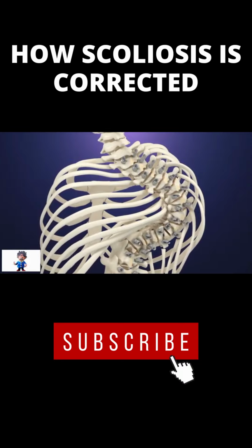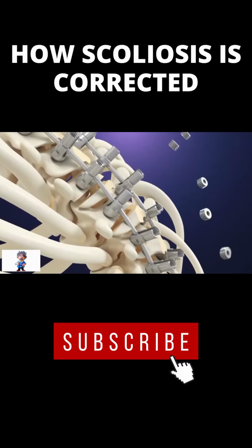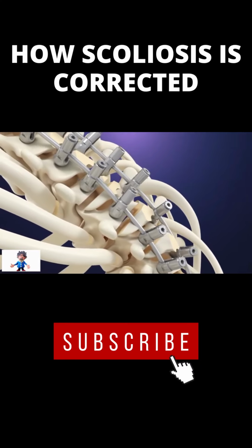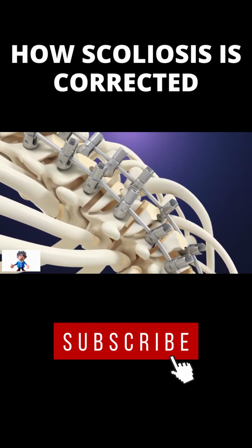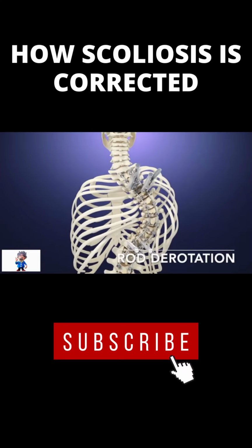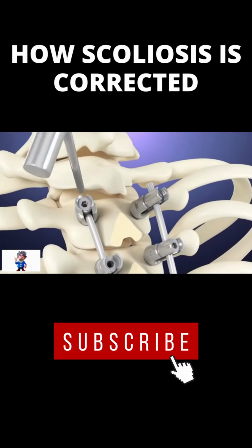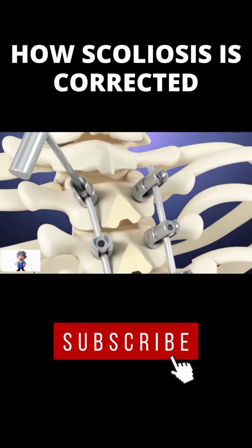The surgeon then assembles the rods, carefully feeding a straight metal rod into each screw head. The final step in the correction of scoliosis is rod derotation, which is a technique where the surgeon simply rotates the rod slowly in order to straighten the spine, thereby transforming a pathological curve to a normal physiological kyphosis or lordosis.